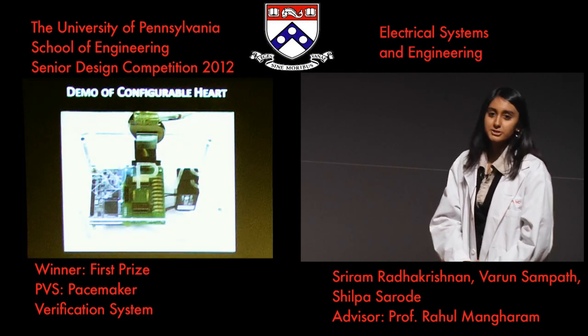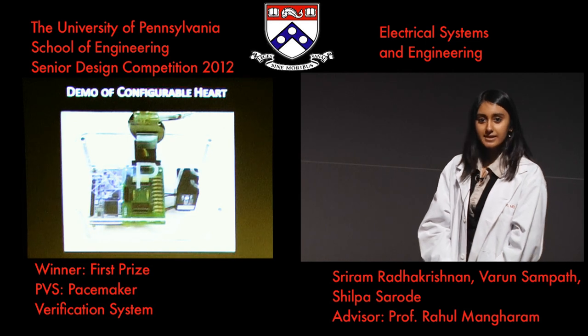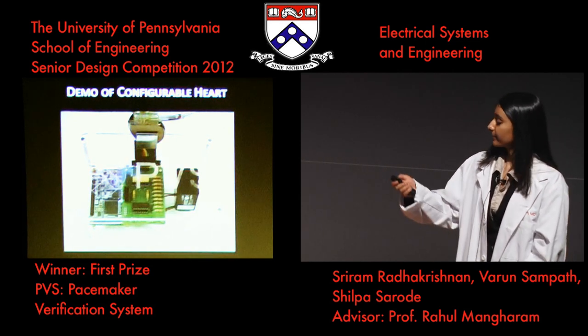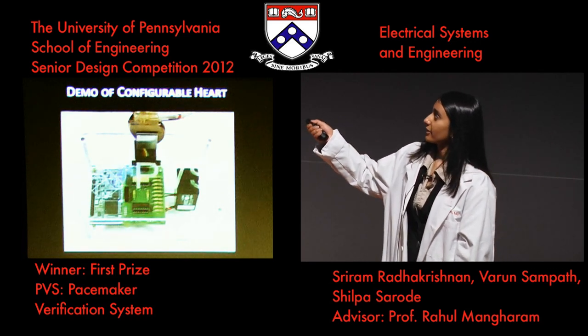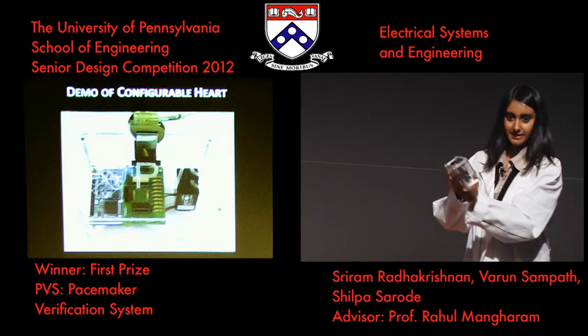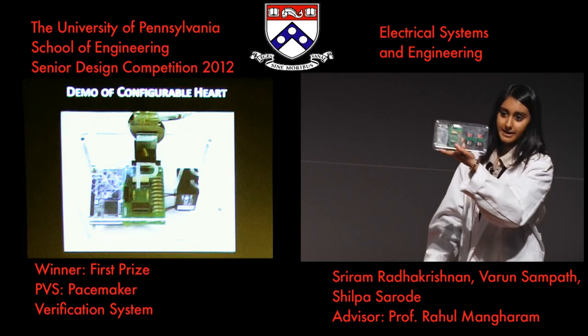So we will now demonstrate to you the implementation of our heart, which you will find has the ability to embody a variety of heart conditions. This device right here is our heart on a chip. And it is on our project board that is about this size right here. This is a duplicate of the one that is hooked up right now.